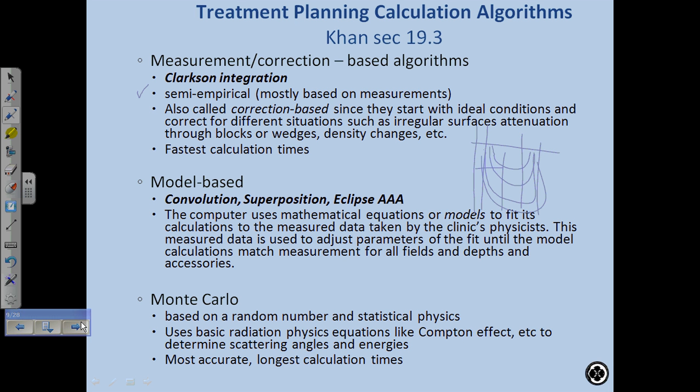It takes the data that you've measured, profiles, puts them in an isodose shape on a grid, some kind of grid, and adds them up. Okay, that's all it does. And then what about a wedge? Okay, we don't take wedge profiles. So how does it handle a wedge? How do you think it handles a wedge?